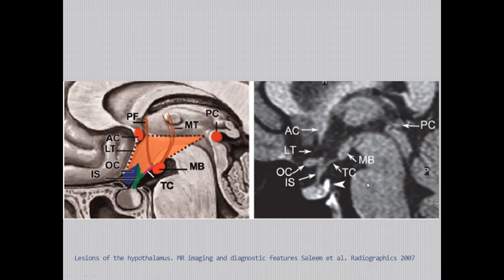On the MRI, this is the region of the hypothalamus, limited anteriorly by the lamina terminalis, superiorly by a line joining the anterior and posterior commissures, posteriorly by a line joining the mammillary body and posterior commissure, and inferiorly by the tuber cinereum and optic chiasm. This is the stalk and sella housing the pituitary gland.